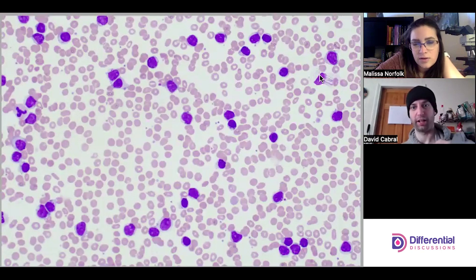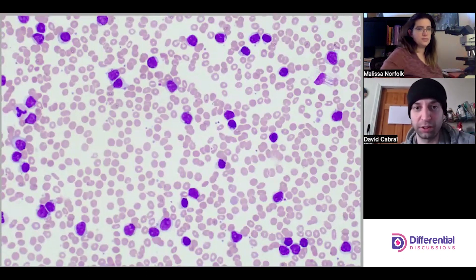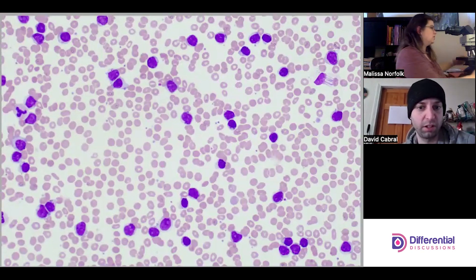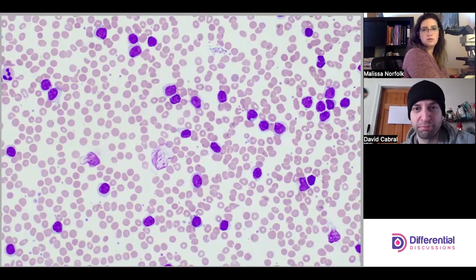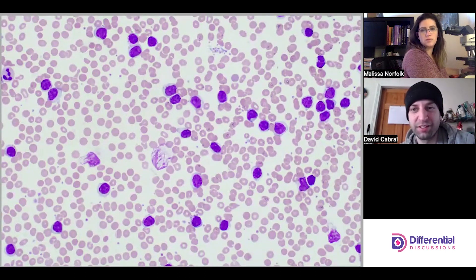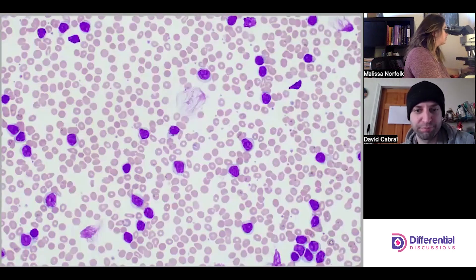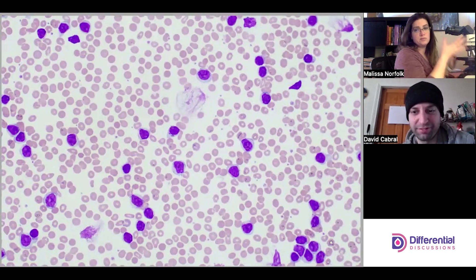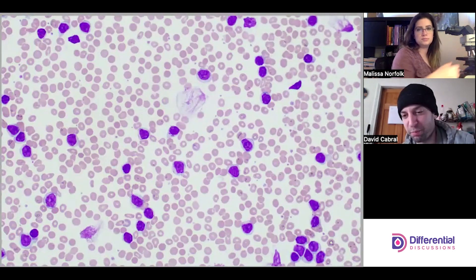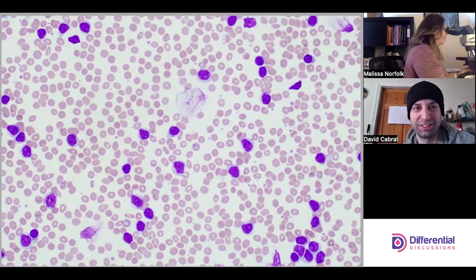I see maybe one smudge cell in the corner, and there are a few more, but still not prominent the way we'd expect in typical CLL. This might be a strange variant. They're definitely there, just not quite as often as we're used to. I like that giant clump of lymphs in the bottom right — very suspicious.